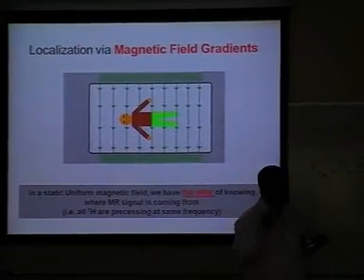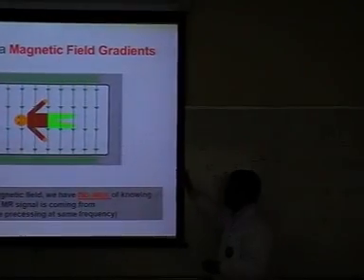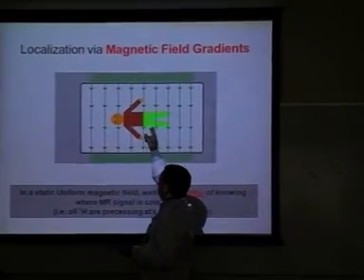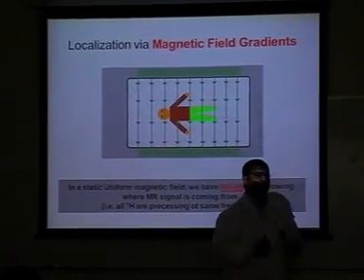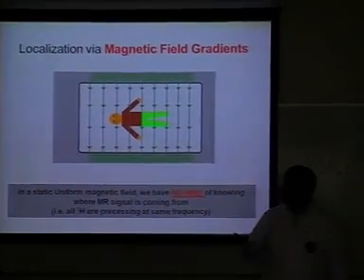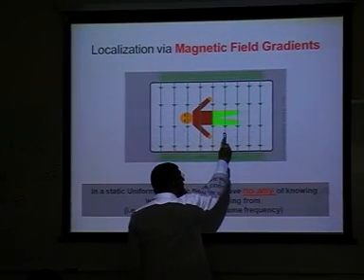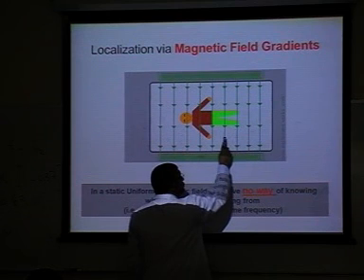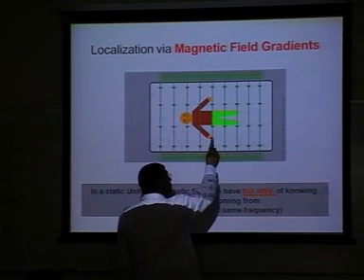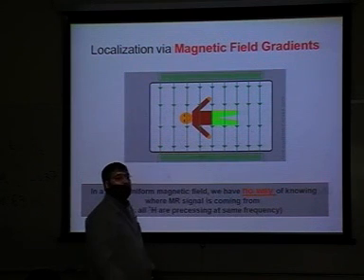Do you think there is any difference between the exposure of any of these protons to the magnetic field? If I wanted to calculate the resonance frequency here, F is equal to B times gamma. So it will be the same here, the same here, the same here. Meaning what?